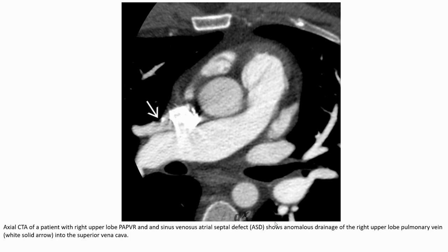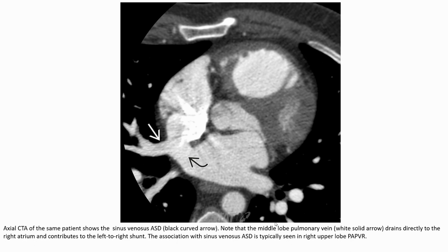Axial CTA of a patient with right upper lobe PAPVR and sinus venosus atrial septal defect shows anomalous drainage of the right upper lobe pulmonary vein (yellow solid arrow) into the superior vena cava. The middle lobe pulmonary vein (yellow solid arrow) is also shown draining directly to the right atrium, contributing to the left-to-right shunt.